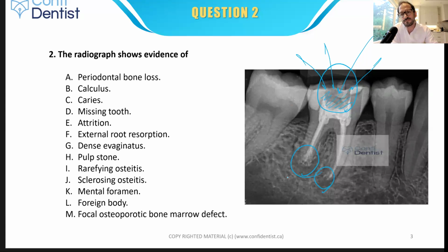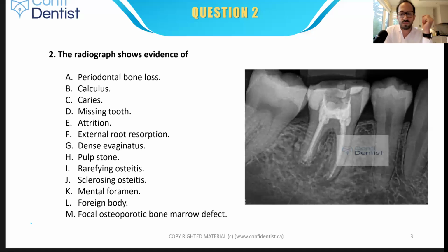Apical scar? Why is it not an apical scar? So, you know, we have 3 types of scars. We have apical scar, we have surgical scar, and what is the third one? The 3 types of scar that you guys should know: apical scar, surgical scar, and the third one is, excellent, bone scar. Okay, bone scar. So which one is this? This is none of them.